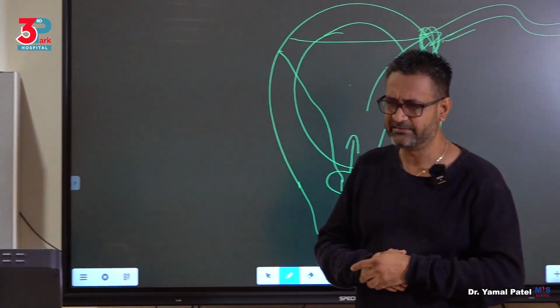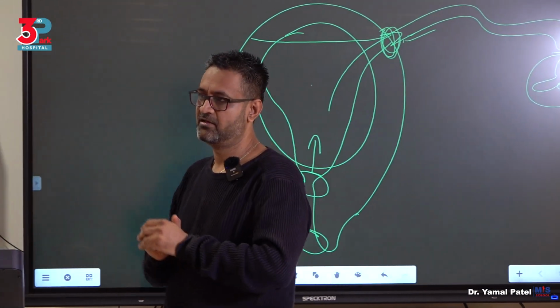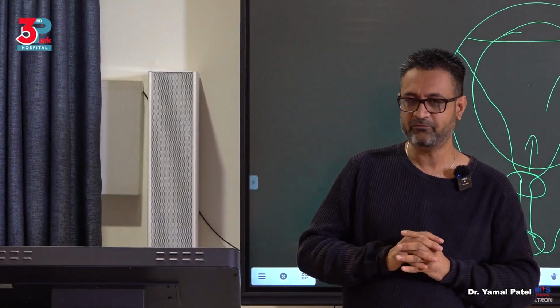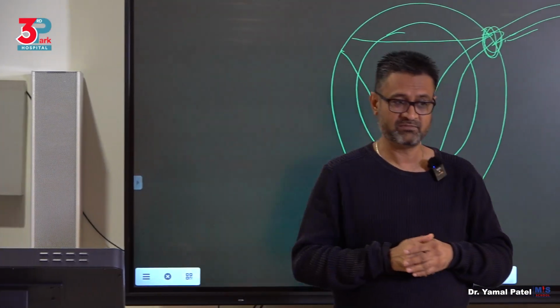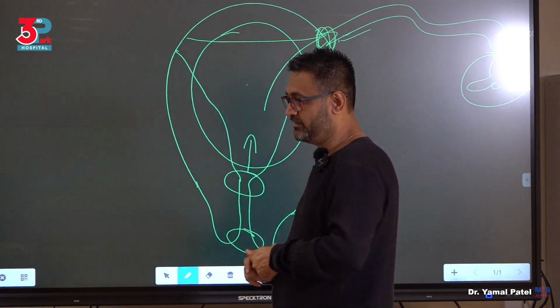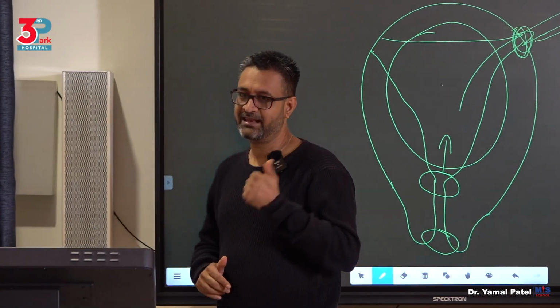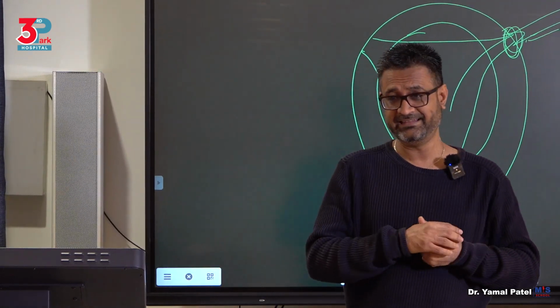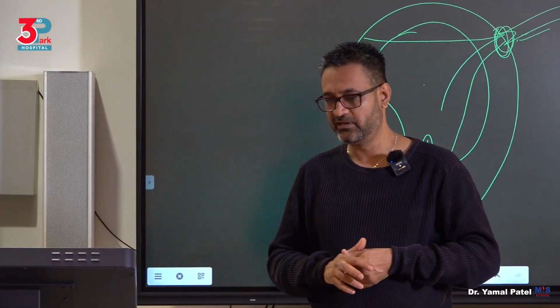So it's a very dangerous scenario to have an overload of a hypotonic solution. Same with hypertonic, again, there is a problem because you will get dehydration, okay? Whereas if you take isotonic, the electrolyte imbalance issue will not be there. But what can still remain is fluid overload.